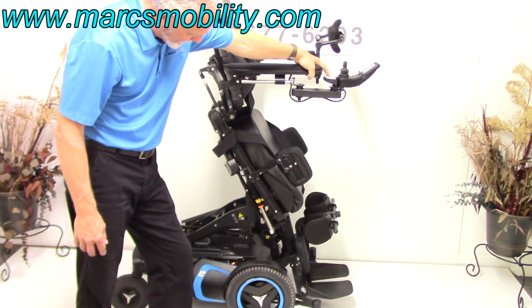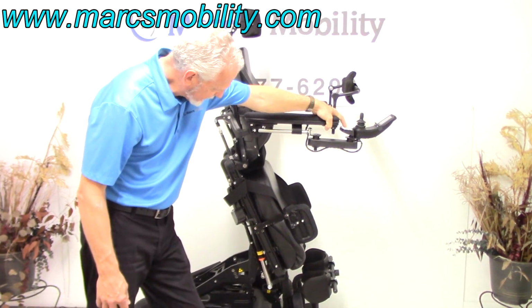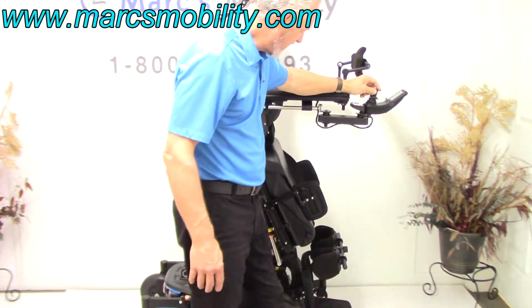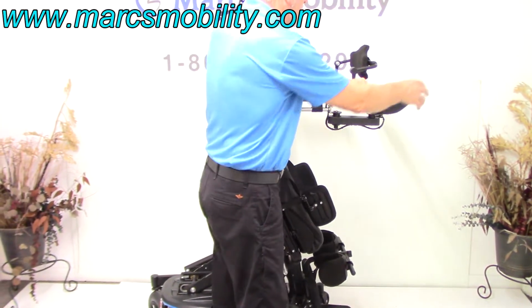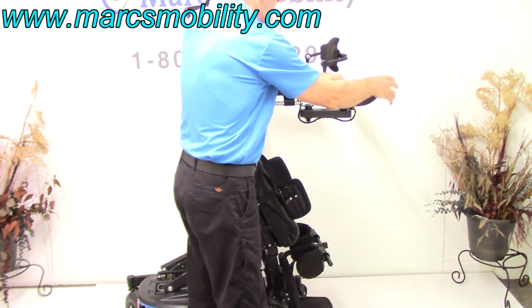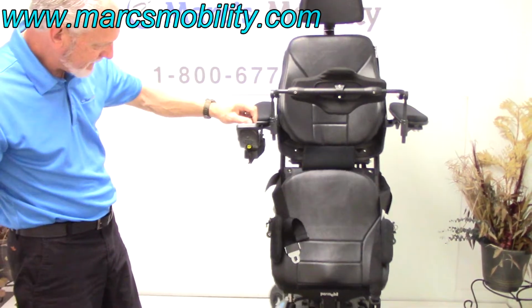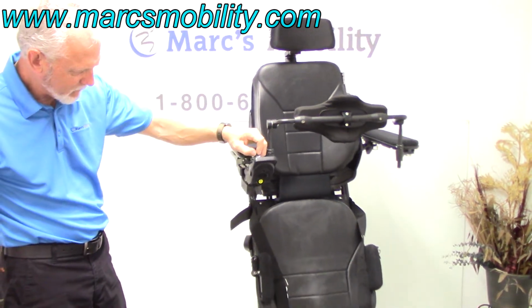So now, this would be your standing feature right there, okay? This is your standing feature. The chair will still drive while you're standing. So the nice thing about this chair, as I said, let me move the speed up a little bit. I'm going to turn around so you can see it. It'll drive about 1-2 miles an hour standing.